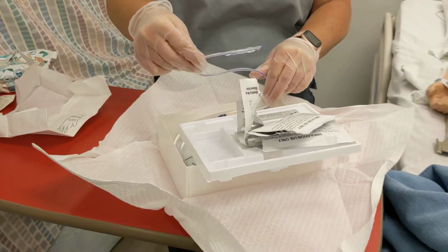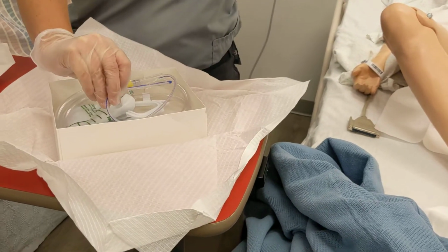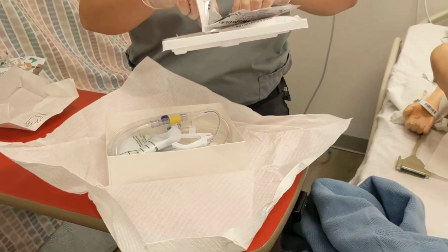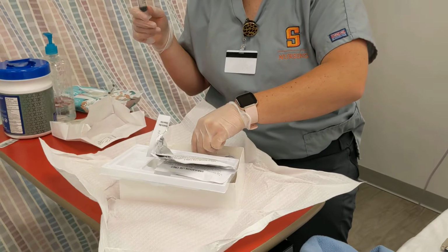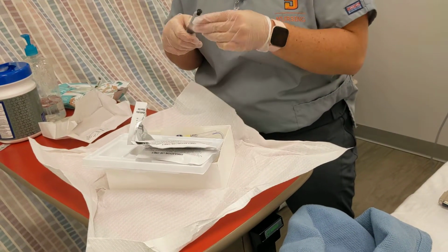Just take that back in here. I'm gonna get my saline. I'm gonna hook it on.